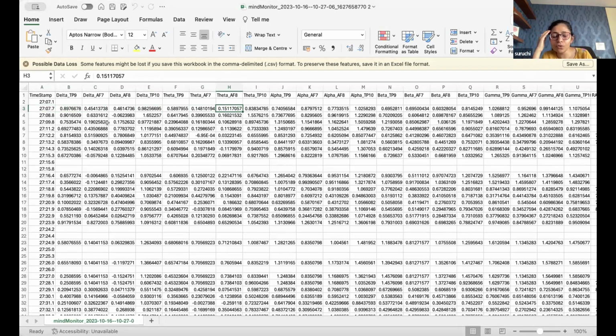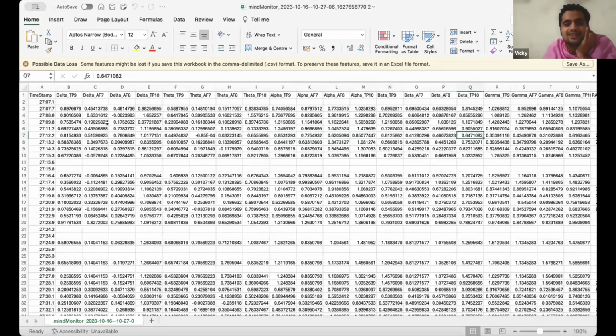So if you can't locate the raw data, you have to go over the Muse band's manual and see what it is giving. Is it amplitude? Is it power? It's already done the analysis for you. There's not much I can explain here because it's already done, and I don't even know what was done. It will be really difficult to write a paper if you don't know what they have done here. It's a good apparatus if it gives power directly, but that's not good for researchers.